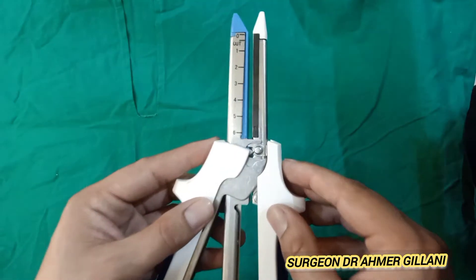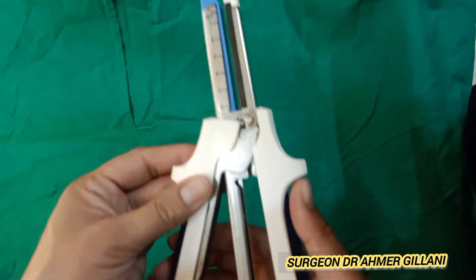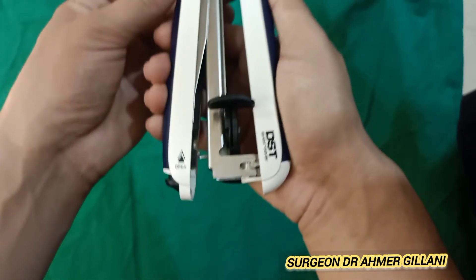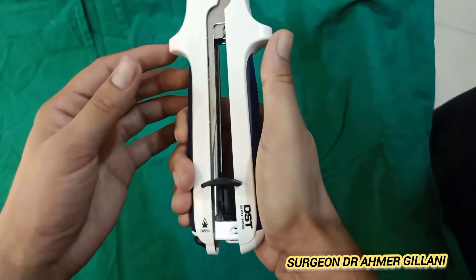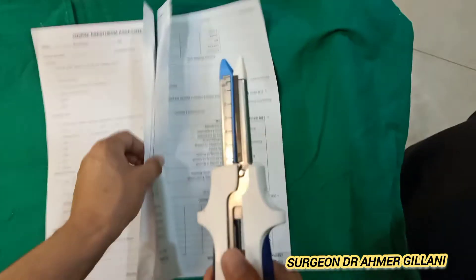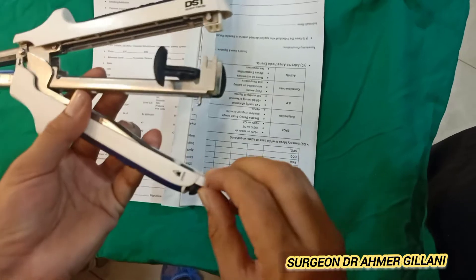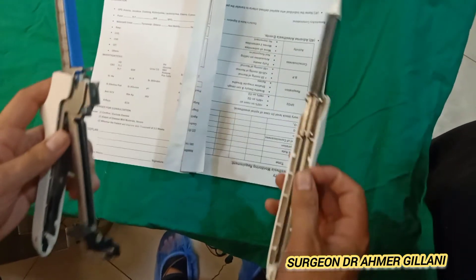Both parts will come in front of each other. After that you will press this so it will be locked. Suppose there are two loops of the intestine — for opening, you will press it like this and it will open.